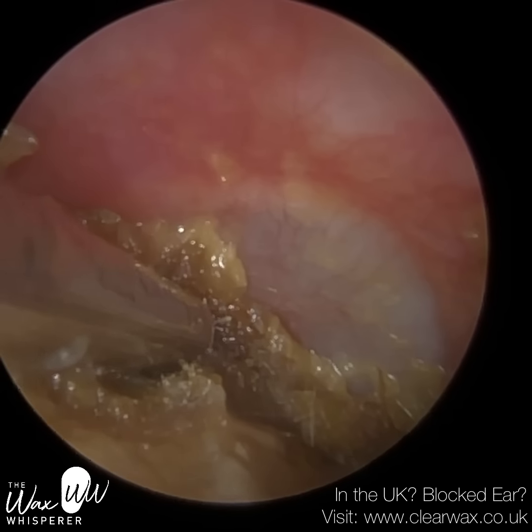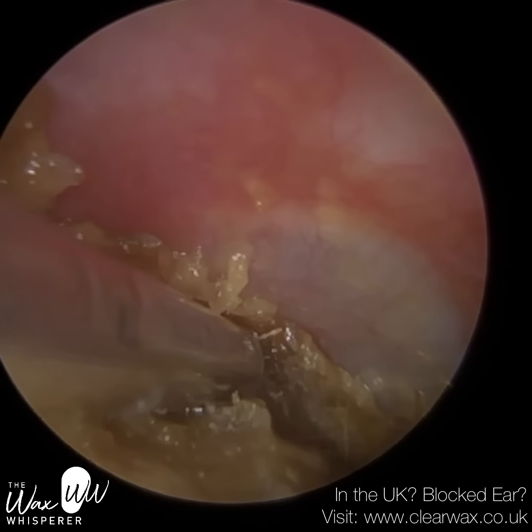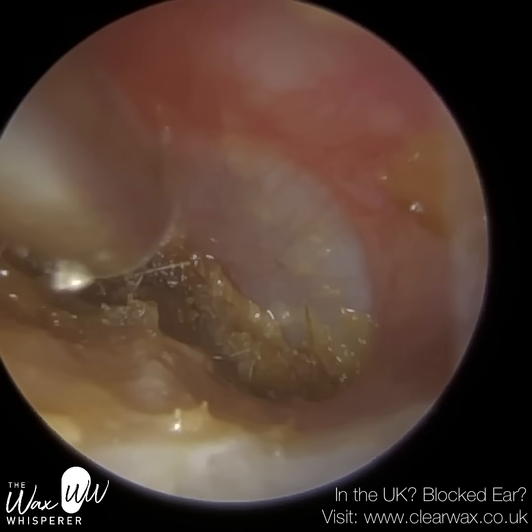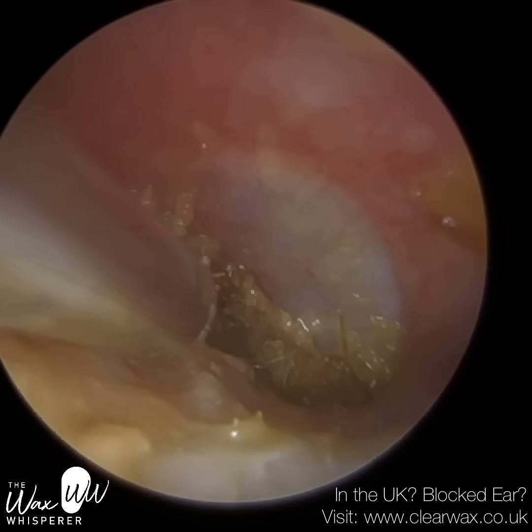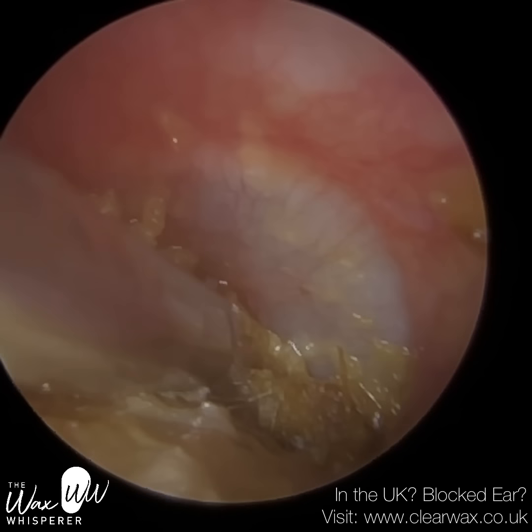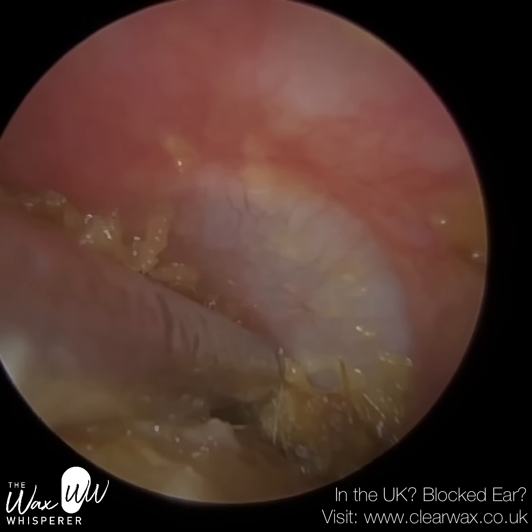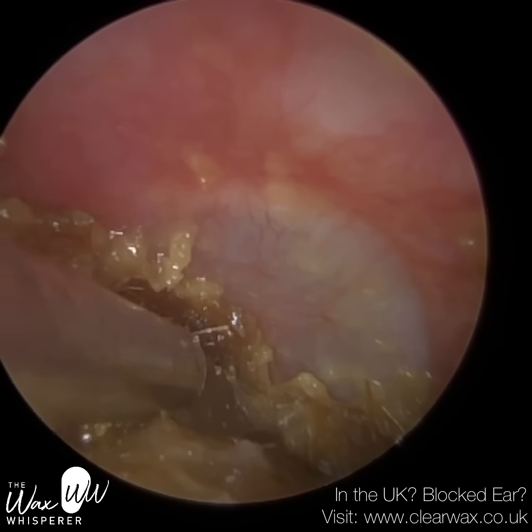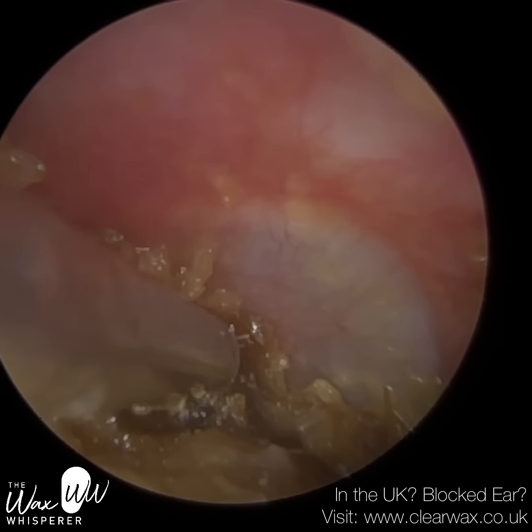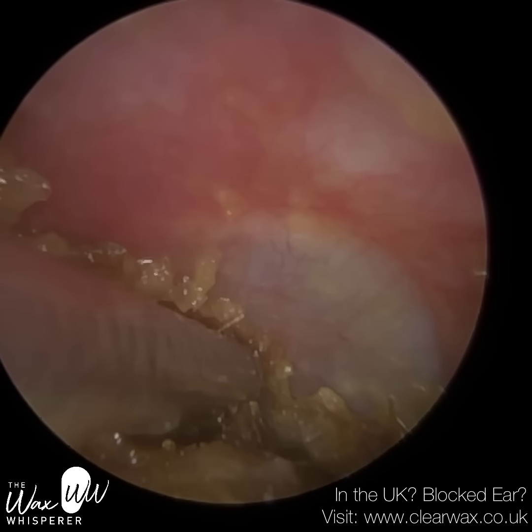So far we can see the back half — the back hemisphere of the eardrum — but the front part is still completely blocked, lodged in the anterior recess. As we approach the eardrum, the ear canal narrows and then widens again. In the case of the left, it widens to the left, and that creates a hidden alcove and a recess. Quite often you can get wax and dead skin entrapped in that alcove, and it's very difficult to remove or get access into.